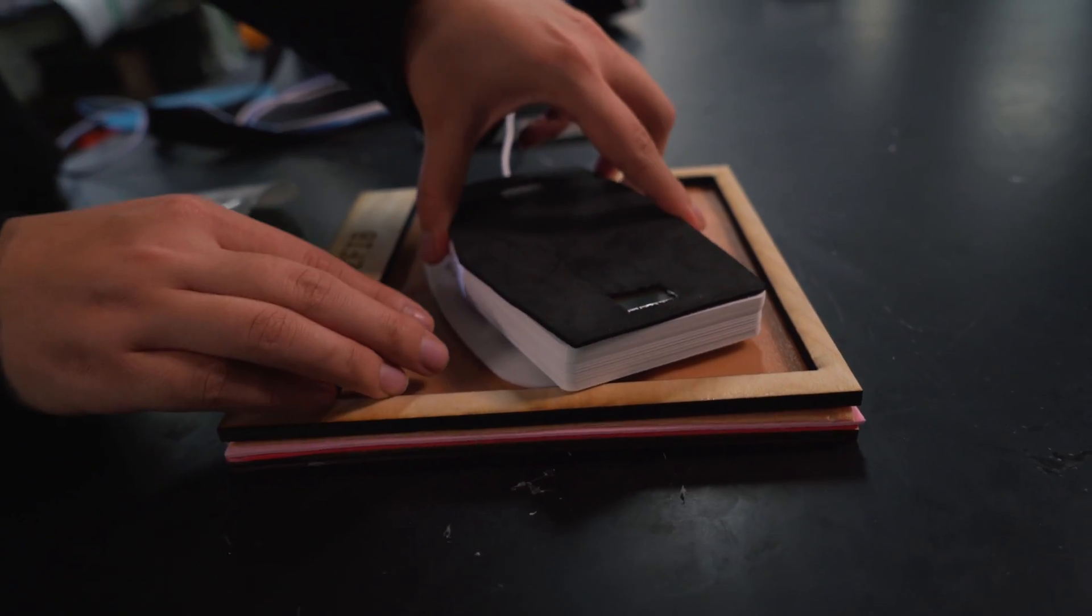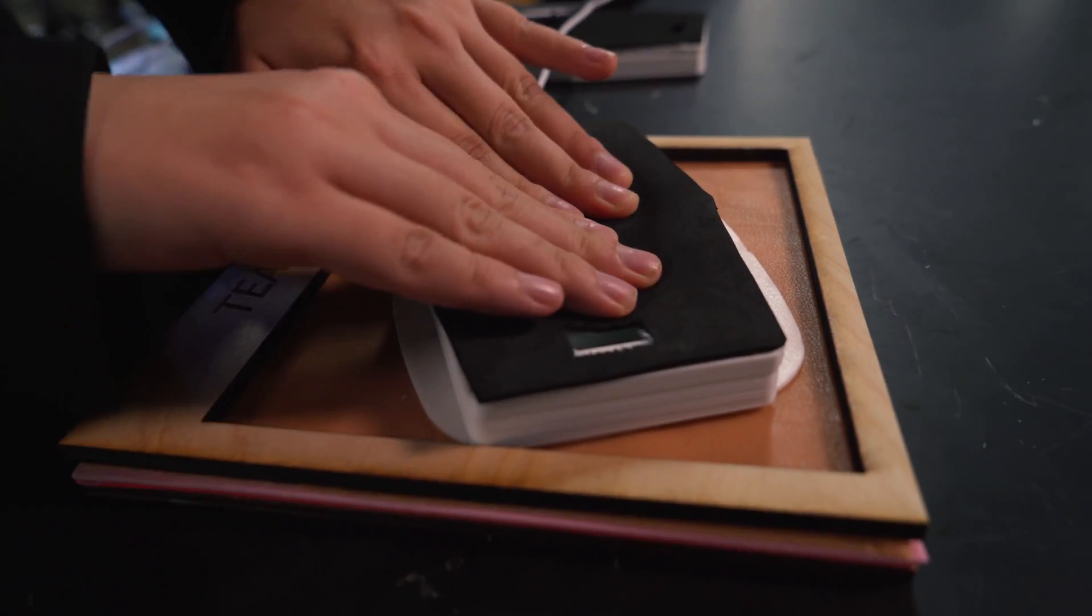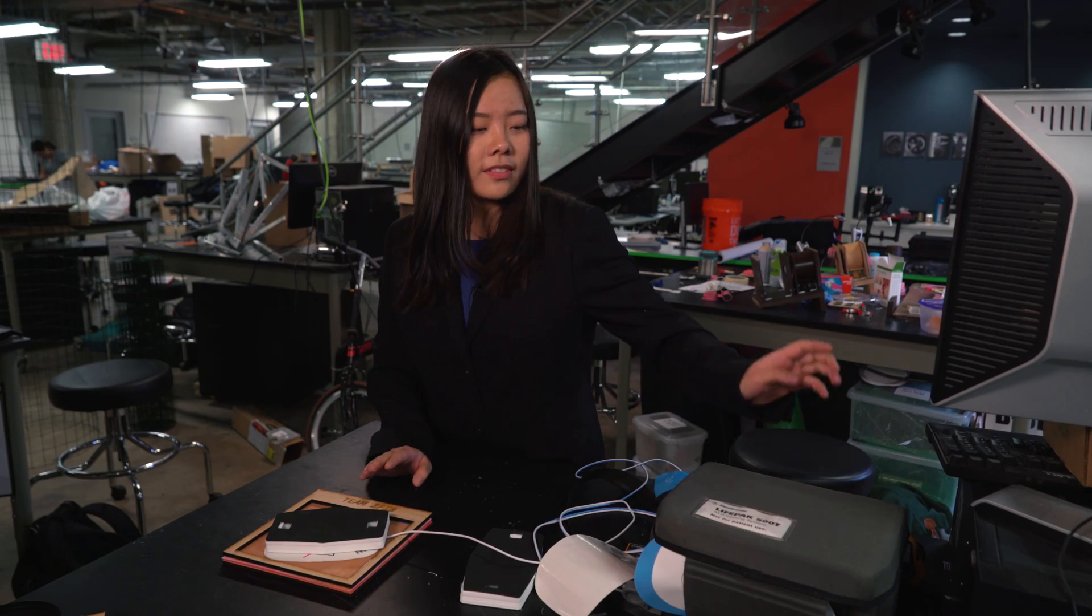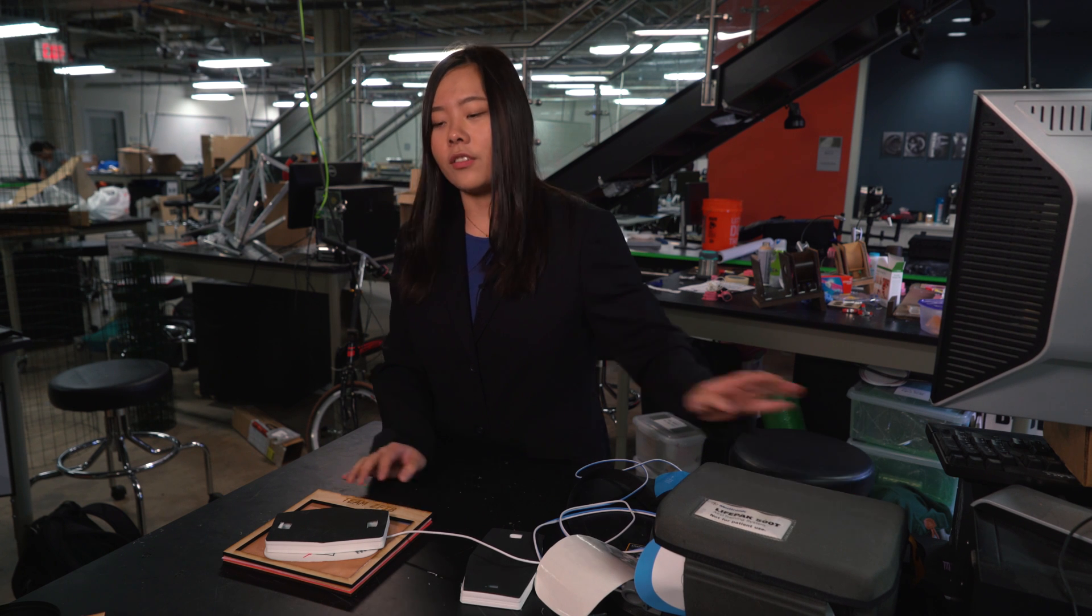We simply press down to the skin and the needles will penetrate through the skin, and then we can use the AED again to defibrillate the patient.